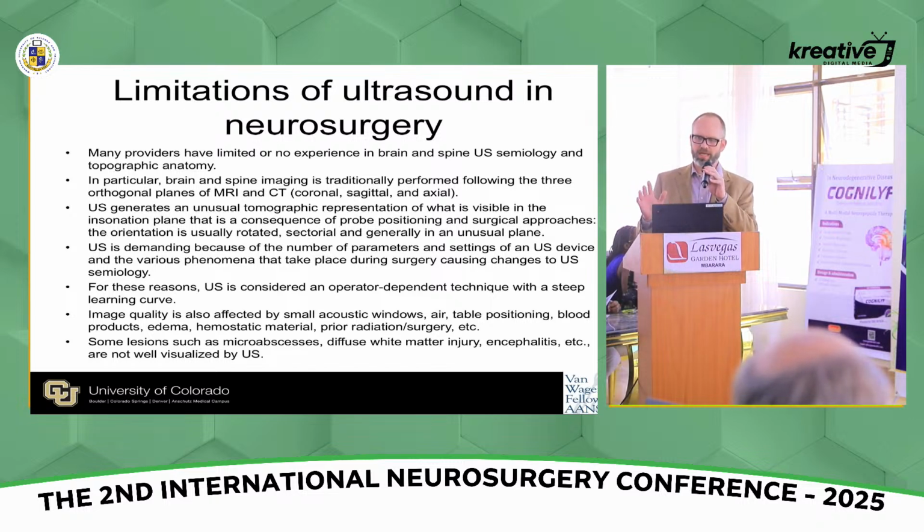If you set it to abdomen, for example, the abdomen is similar to the brain in terms of settings that you want on the ultrasound machine. So if you start with abdomen, then a lot of those things are adjusted, and then you only need to make 2 or 3 different adjustments. Zoom, gain, and frequency are really the only 3 that you need to mess with after setting it to abdomen, at least in the beginning, okay?